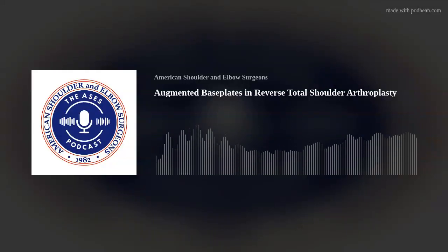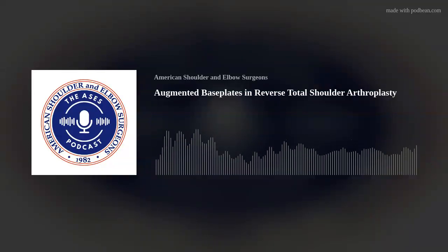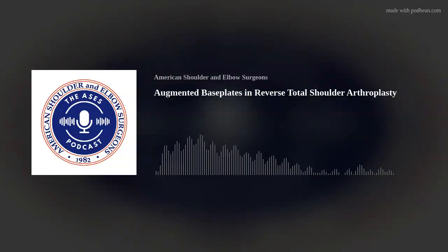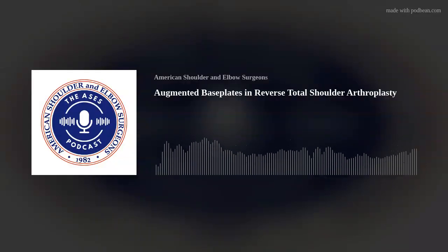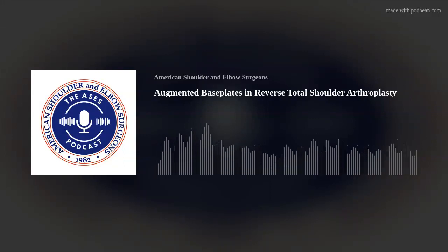We touched on inclination a bit. I just want to put a couple of points of thinking about it, which is I think we're not really good at measuring inclination postoperatively. And there's this dogma that we need to go to zero of inclination. And I'm not even sure what that means. I'm not sure we all even agree with that. I think you can be superiorly inclined a little bit. And so I think those measures are a little bit off.